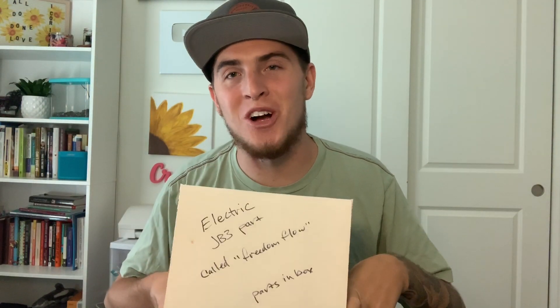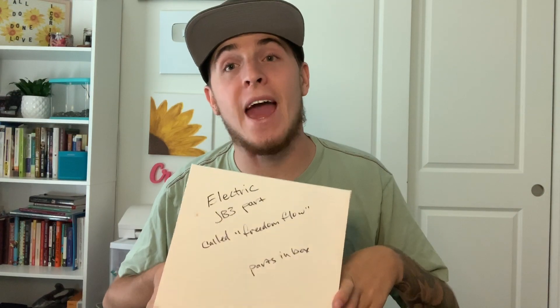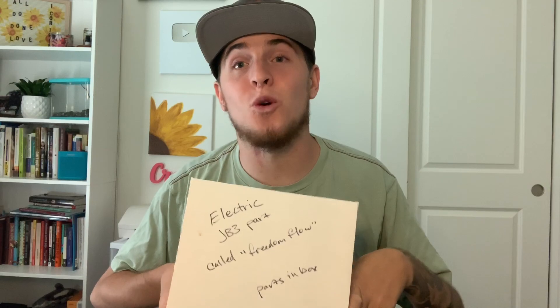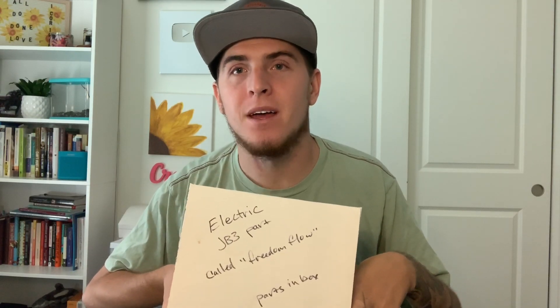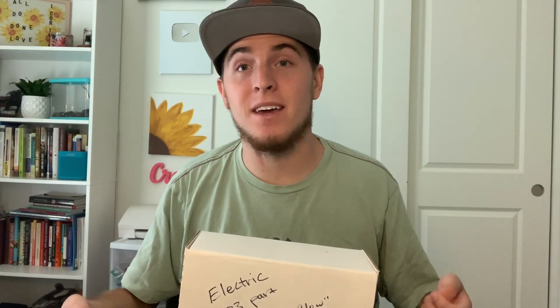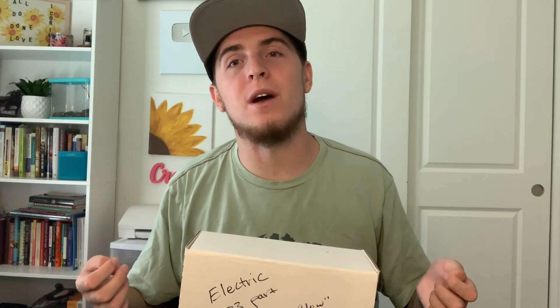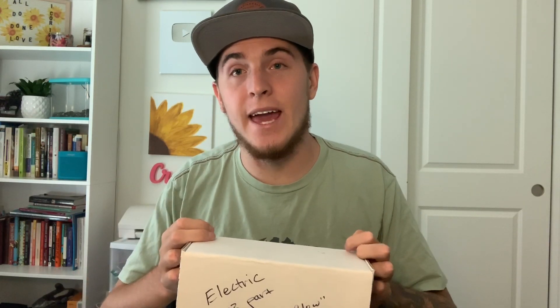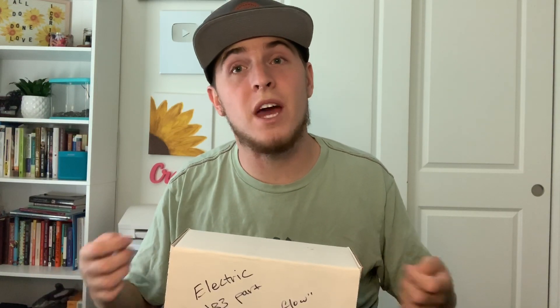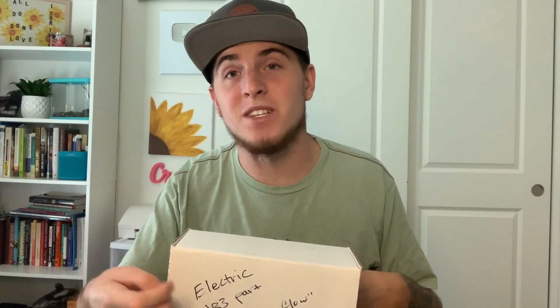I know this box doesn't have a picture on it so you can't really see what it is, but I'm going to pull everything out to show you. Basically, this is a new product on the market and it's a wireless leg bag emptying system. I found this on the internet and had to order it and give it a try because I thought it was super cool. It's called the Freedom Flow and I want to open it for you and show you the three parts it comes with — it's only three pieces, technically two that you use, and the charger is the third piece.